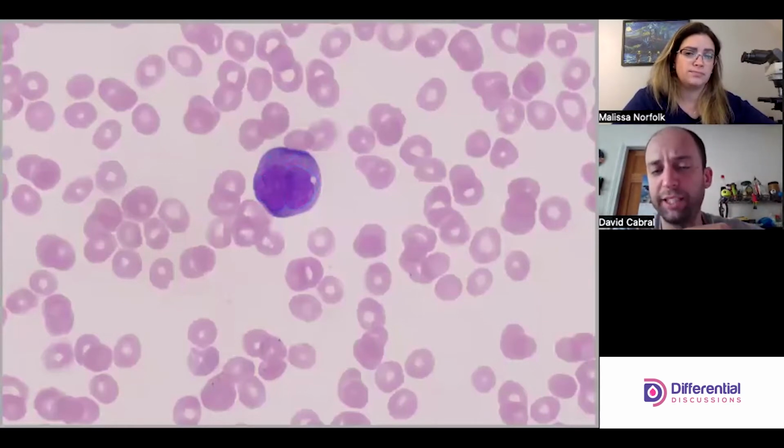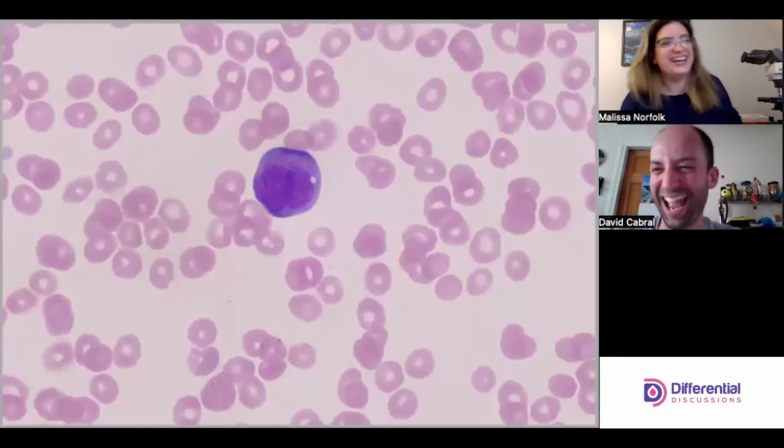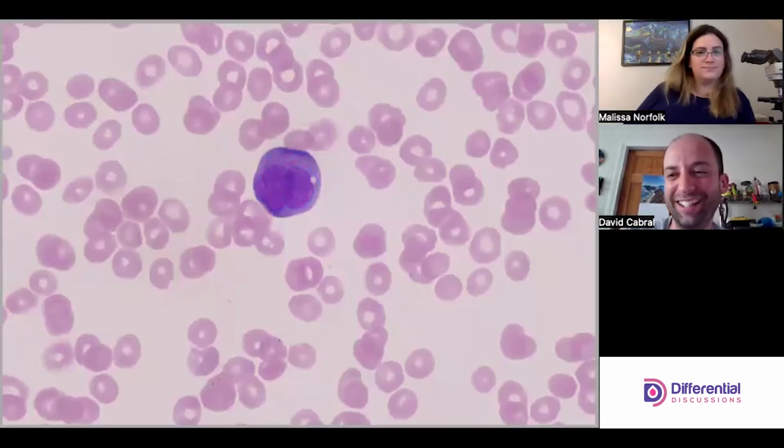What's fascinating about this particular leukemia, maybe we'll talk a little about pathophysiology because it's relevant in a lot of different domains. For the students out there that will eventually take their board certification exam, what's cool about this leukemia is it has a translocation that we know and is well documented, and that's t(15;17). It's like you're asking me. I am. t(15;17), PML-RARA. Yep, PML-RARA.